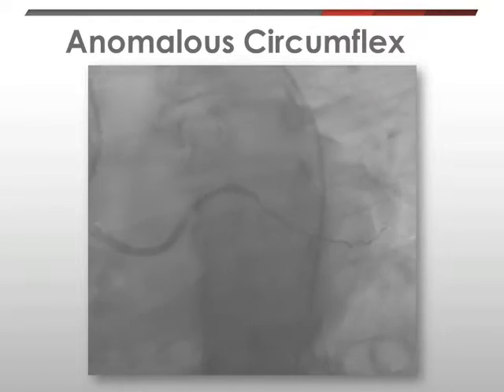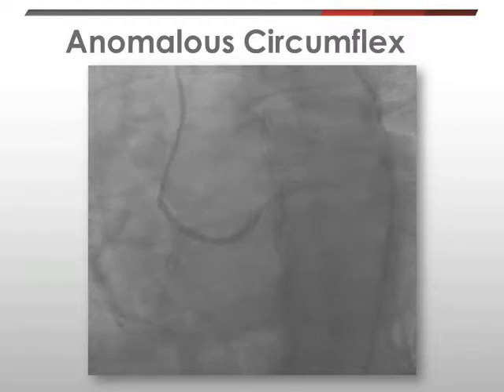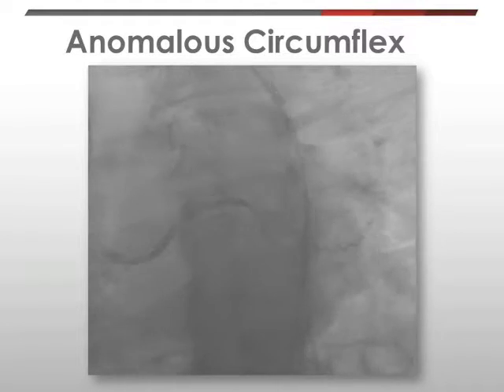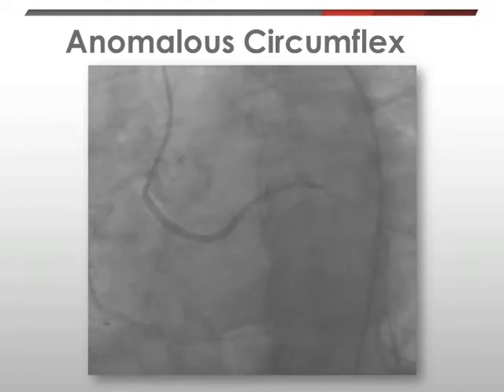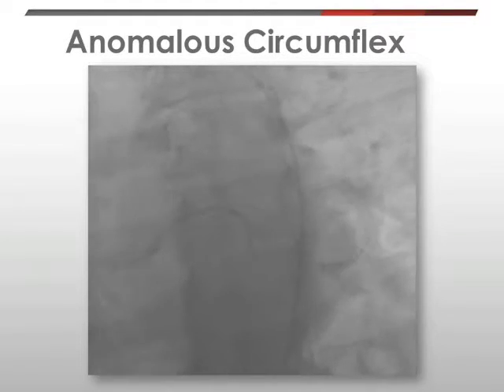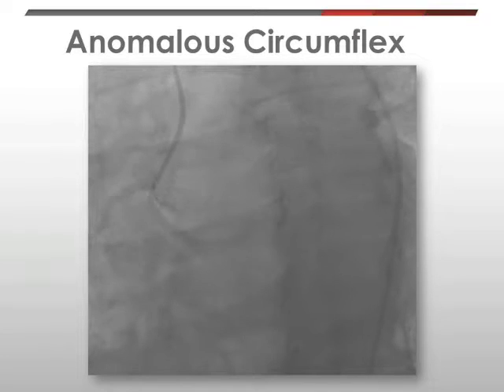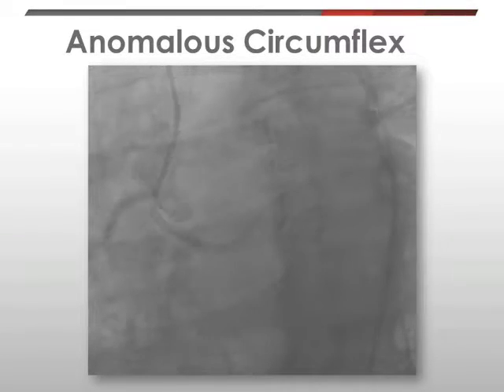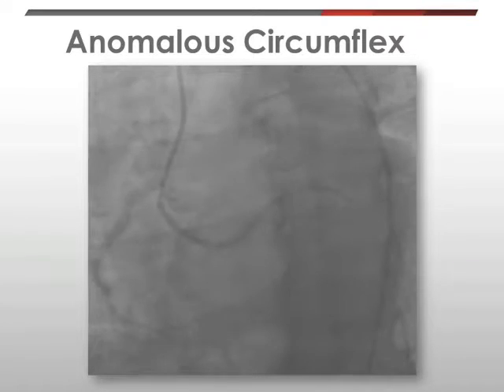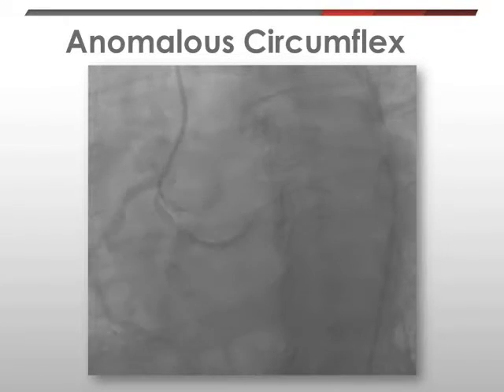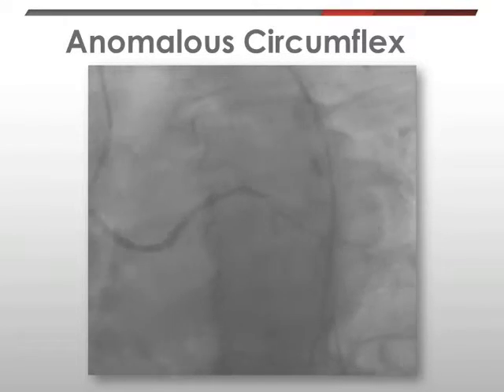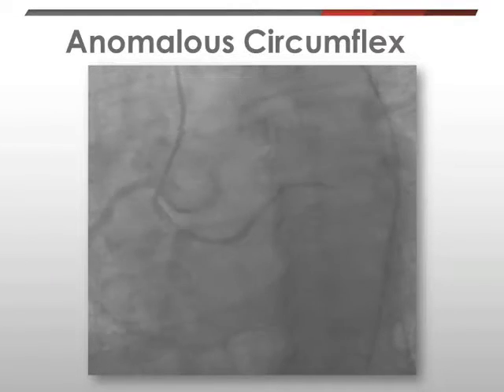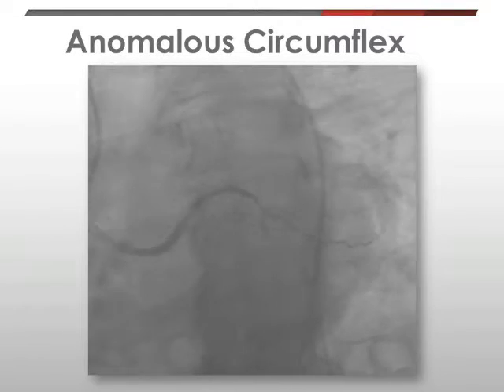Selective angiography of this vessel now demonstrates moderate indeterminate narrowing at its ostium, and moderate to severe focal stenosis in its mid-portion as it traverses the AV groove. Distally, you can see it give rise to a first obtuse marginal, as well as a distal circumflex, which is occluded, and likely chronically.